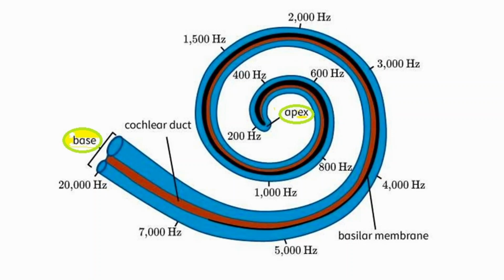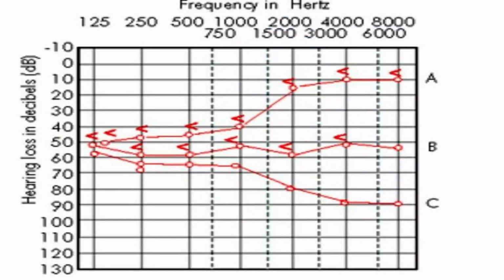So that's why the patient will present with lower frequency hearing loss initially, and then if we look in these graphs, these are the different stages of Meniere's disease. First, there will be the uprising, that lower frequencies are affected, higher frequencies are spared. If disease is progressing, then patient may present at this stage where there will be a flat drop. Or maybe if patient present late, the stage may be that there will be downsloping, as I have showed you in the previous sensorineural hearing loss graphs.